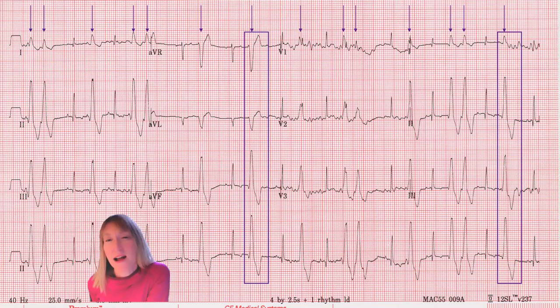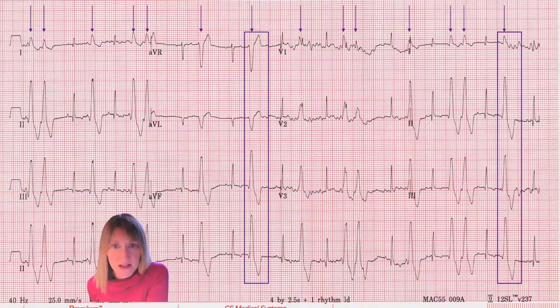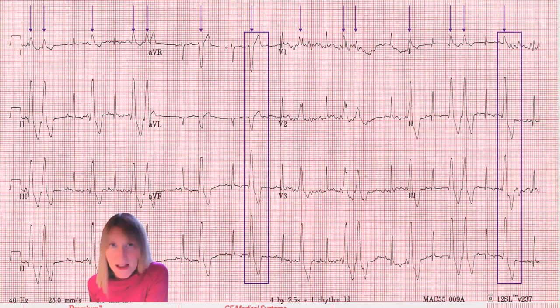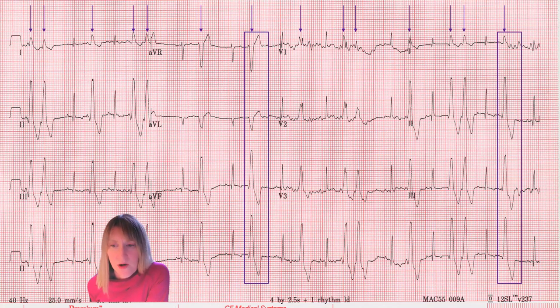What I'm noticing is that in all six of those frontal plane leads, and in the chest leads too, my PVCs have an axis that is the same as the sinus beats. That tells me those PVCs might be traveling roughly right to left, like a sinus beat would, so originating in the right. I'm going to conclude that these are right-sided PVCs.